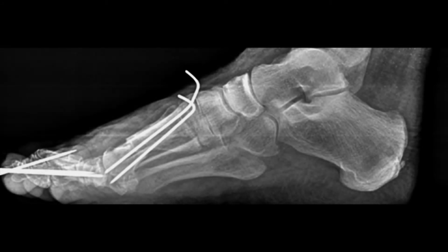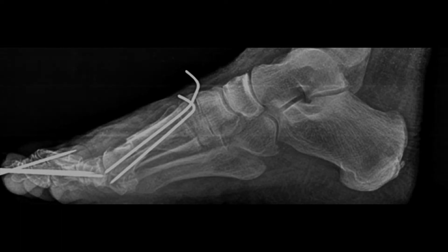The lateral x-ray shows that even at one week we're already getting some primary bone healing, with not a lot of shifting of this fragment. Very stable. The patients don't have hardly any pain with this as well, and we'll talk to her about this.